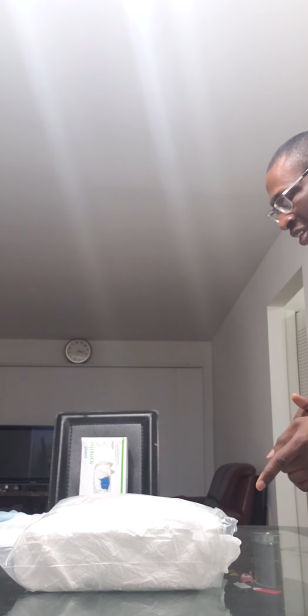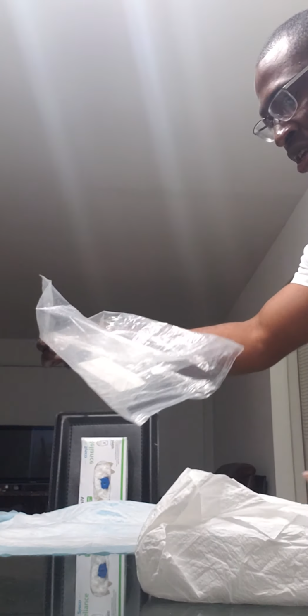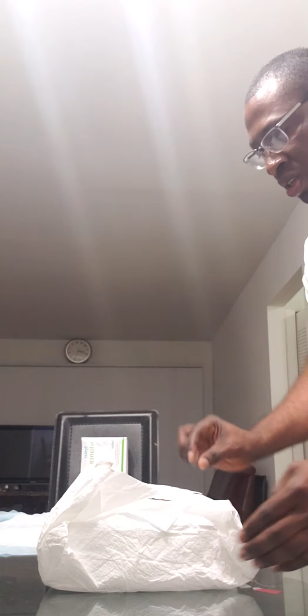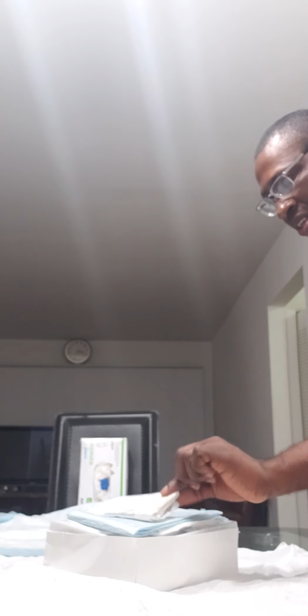Okay, give me a few seconds to set up my Foley kit. Okay. All right. I'm going to use the back as my tripod. Put it here. Okay. Get this out. Adjust it. Observe the borderline for contamination. Get this. Don my sterile gloves. Make sure the arrow points at me.